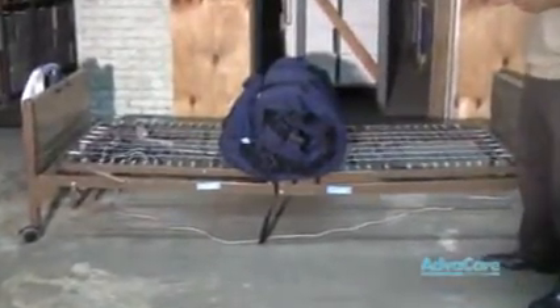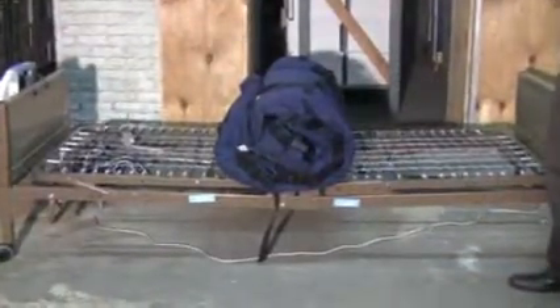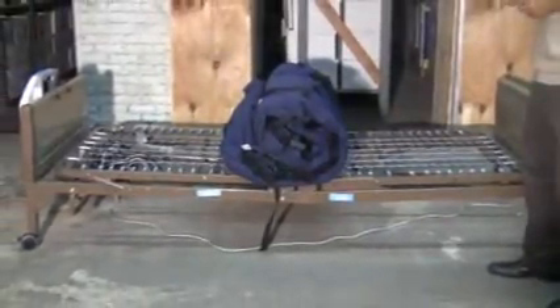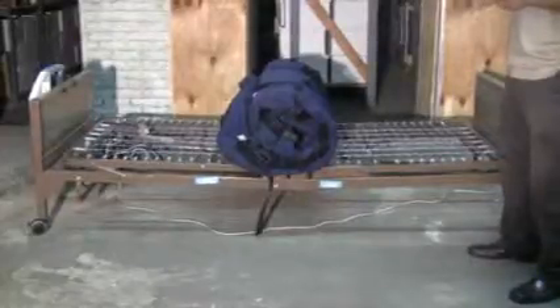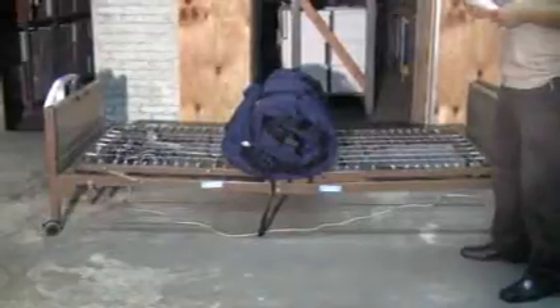The Plexus 2500 is a low air loss and alternating pressure mattress replacement system. It has a weight capacity of 350 pounds and completely replaces the regular spring mattress, laying directly on the bed deck. The therapy is a dynamic system combining low air loss and alternating pressure therapies with a 5-minute alternating pressure time cycle.